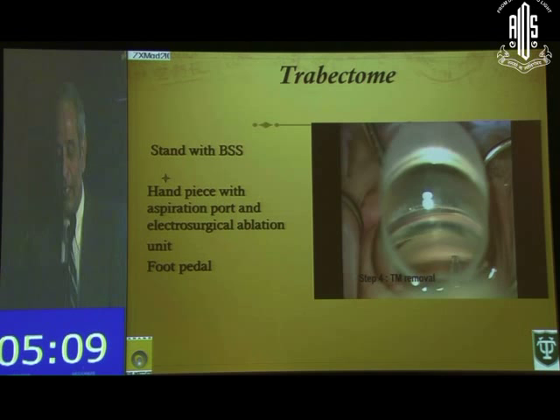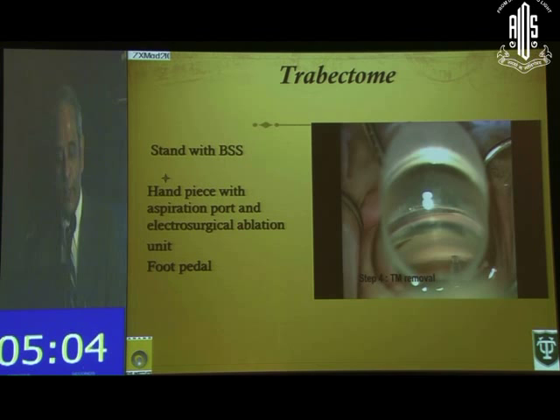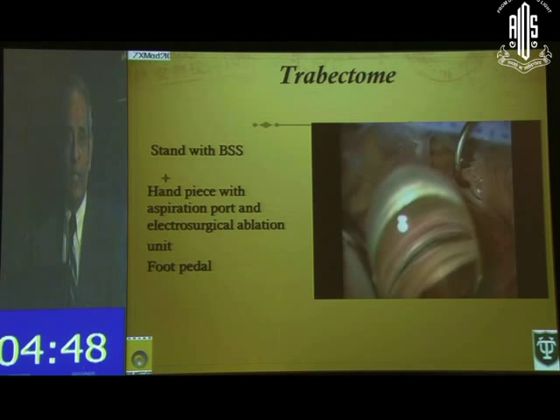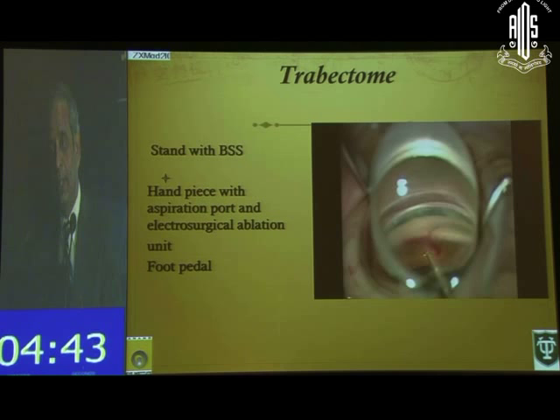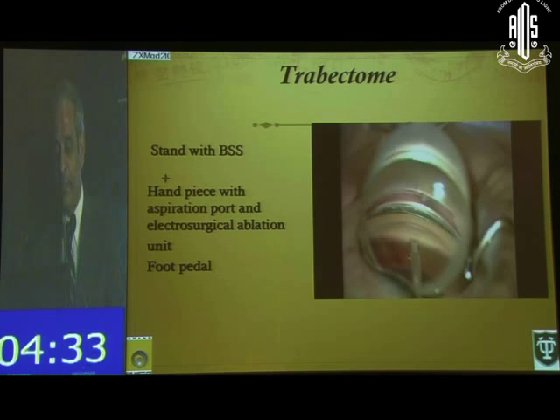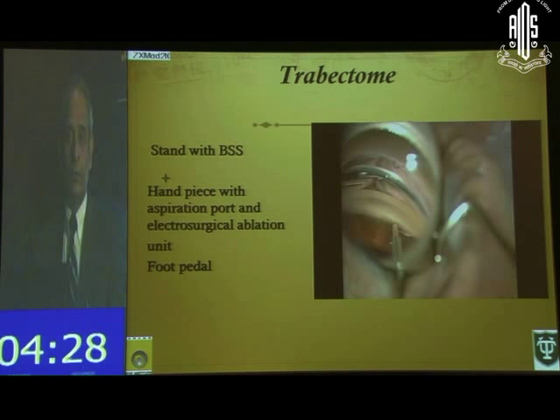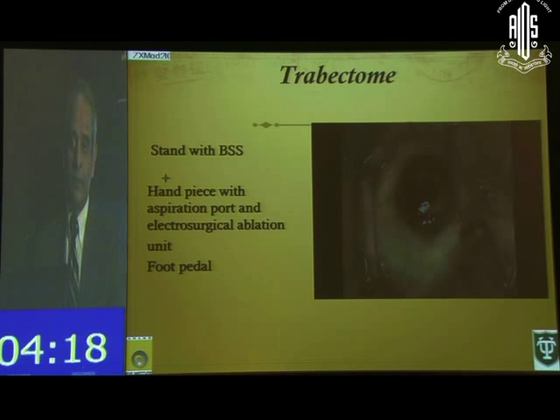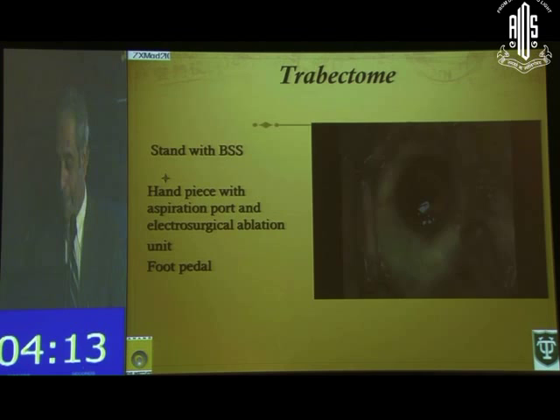Here is how the Trabectome canal surgery is done. It comes on a BSS stand with a handpiece featuring an aspiration port and an electrosurgical ablation unit, and a foot pedal. The idea is to make a clear cornea temporal incision, visualize the angle using a gonial lens, and using the 90-degree bent tip of the Trabectome, access and strip the trabecular meshwork while ablating the edges. This opens Schlemm's Canal directly into the anterior chamber so aqueous can access the collector channels. You open approximately 4 to 6 clock hours, and it takes less than 5–7 minutes when done properly.